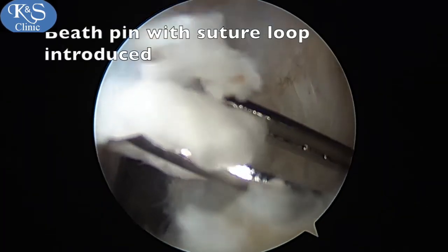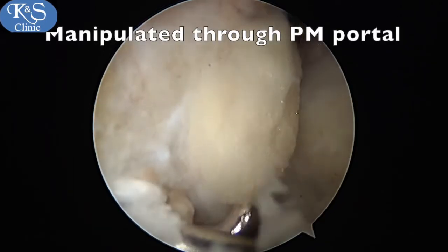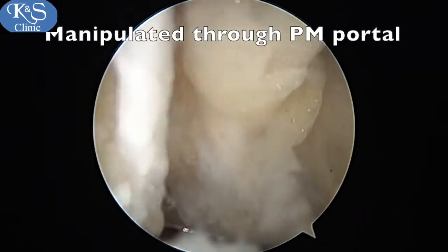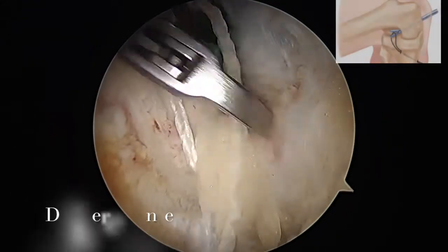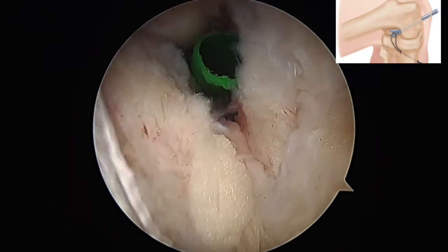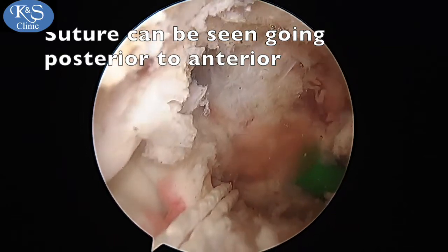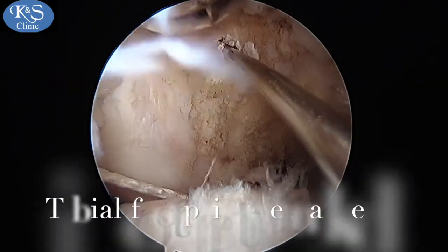A pin with a fiber wire loop is then introduced into the tibial tunnel and the loop delivered through the posteromedial portal. The transeptal approach gives you good visualization of this. It is then pulled forward through a passport cannula anteriorly using a suture manipulator, and you can see how the wire goes all the way back.